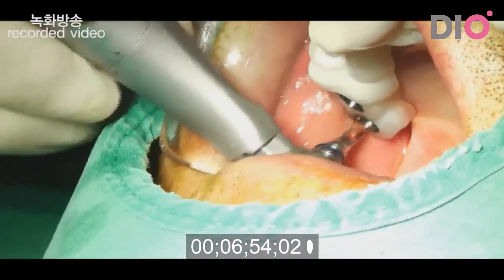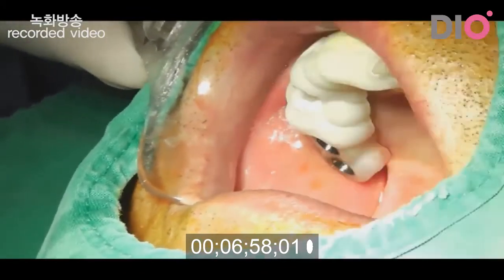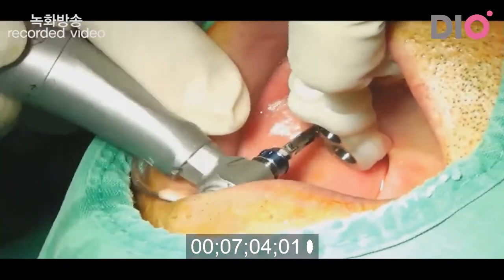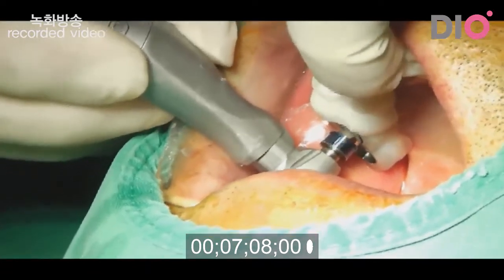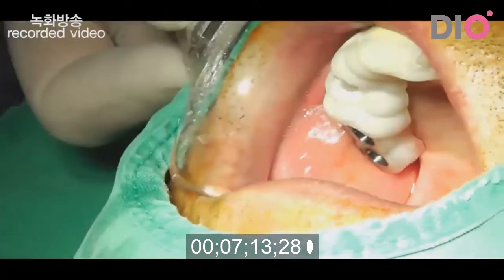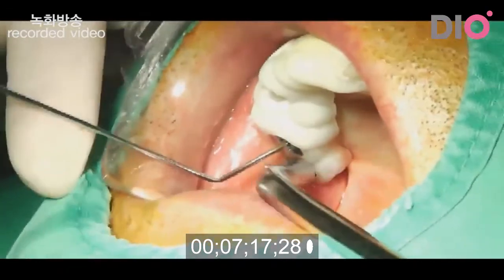3.8 drill, this is also the final drill, 3.8 drill. I drill in the first molar area until the stopper touches the sleeve. Okay. And irrigation.